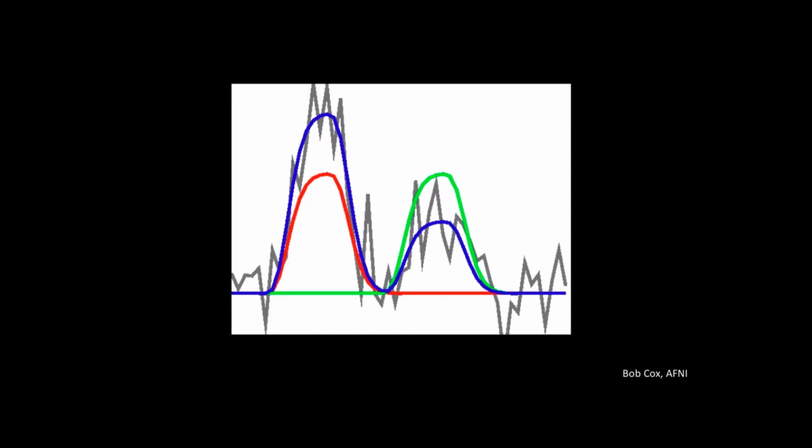And in the approach we're going to do, it's averaged across all the trials, right? How is that an average? Because you're applying that same beta weight to every trial. Oh, so every instance in that regressor. Right. It's not trying to fit an individual beta weight for each trial. You can do that, and we will do that for MVPA analysis. You also see it in more complex designs like a beta series correlation, right? That's another instance where you'd want to do that.